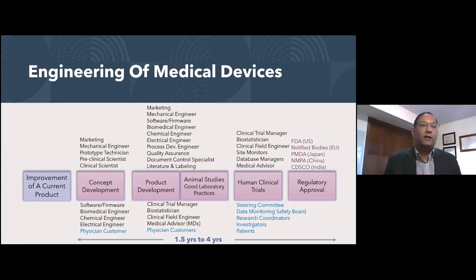So the medical device industry collectively is working together to make sure that they are exchanging information in a big way amongst themselves, so that if they have found certain things in one of their products, they're sharing them with the others so that the others don't make the same mistakes. And just to go back to the manufacturing question, the regulations and the controls that have to be followed in order to make these devices is huge. I mean, there are a lot of electronics involved in this piece.